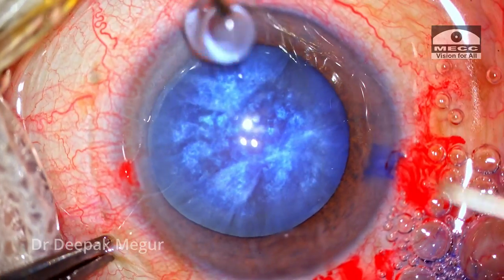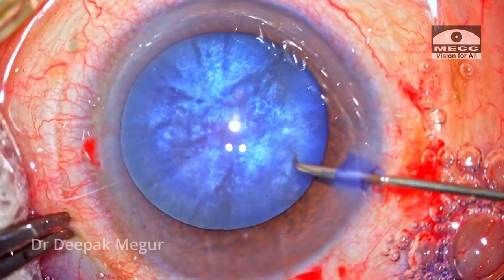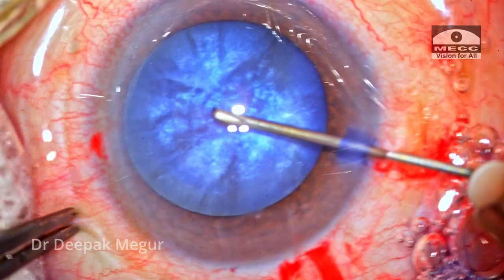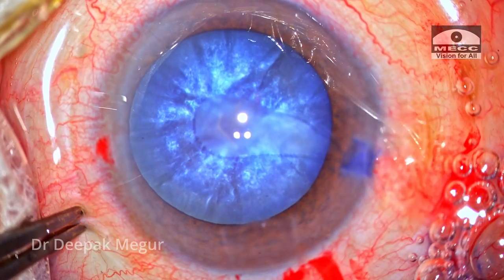The challenge is going to be getting the rhexis right because it's a swollen intumescent lens. The initial puncture is done with a 26-gauge needle, followed by creation of the rhexis using forceps.